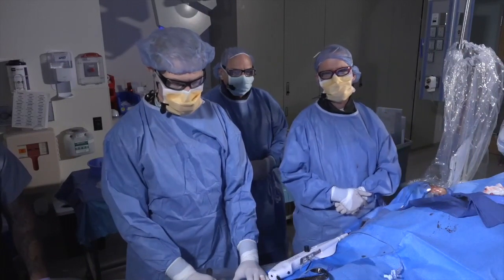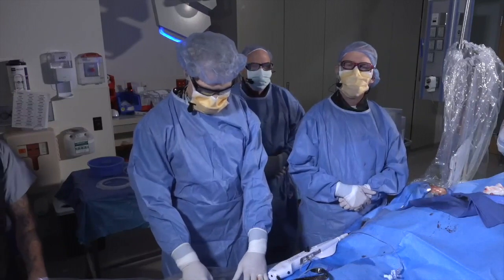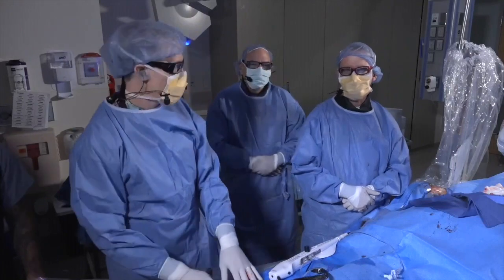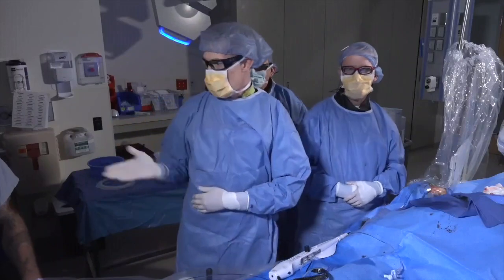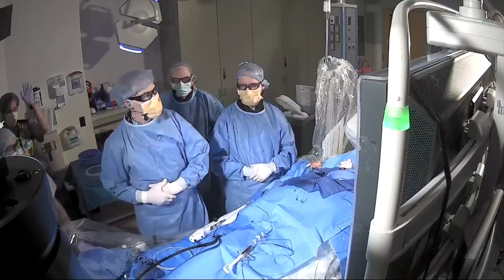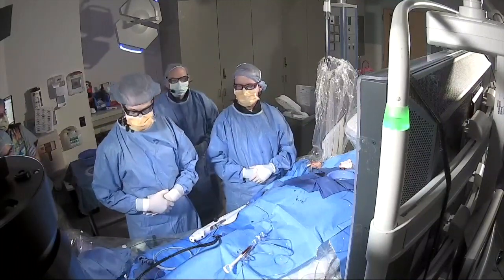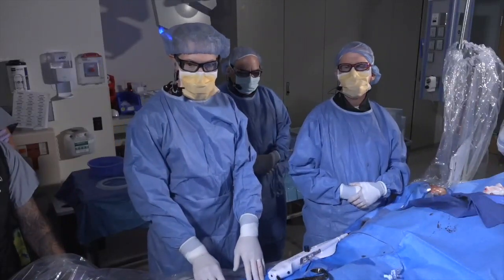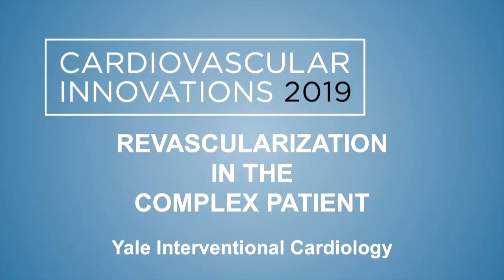Great. Thanks very much. Okay, let me introduce the team. I'm Glenn Henry. Steve Fow. Mike Clement. And this is Dave, Ollie, Sarah, Amanda, and Lauren. So we've got an interesting case, lots of facets of it. I think we'll get started by giving you the presentation of the patient and what we've done so far.